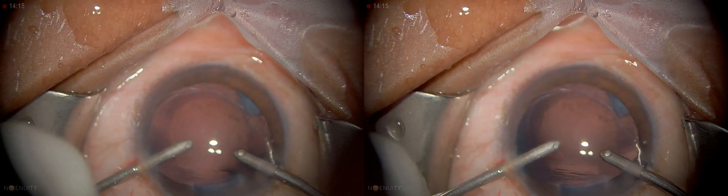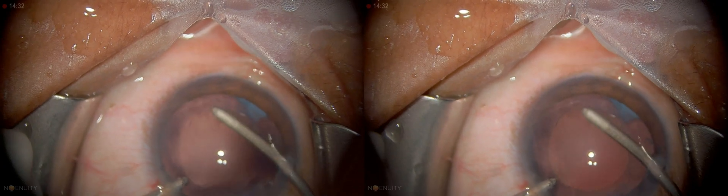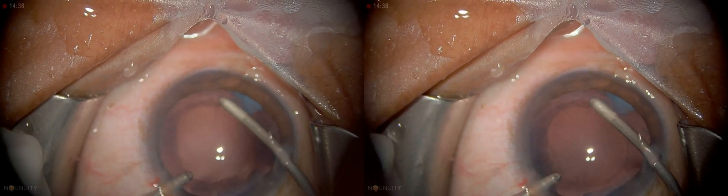So I'm going to leave that and change hands again. There's a little bit of cortical matter there which I need to deal with. The rest I'm going to deal with after I get the lens in.